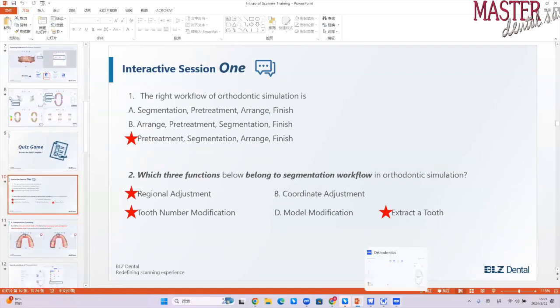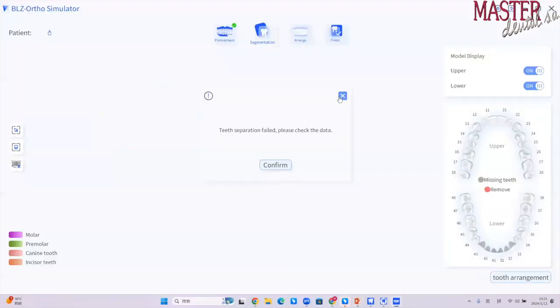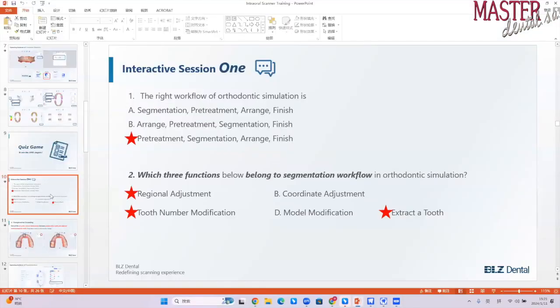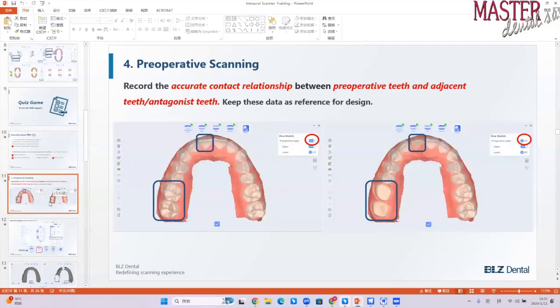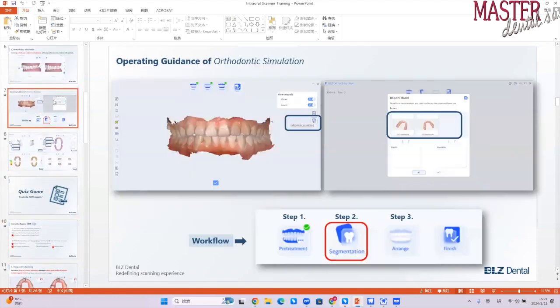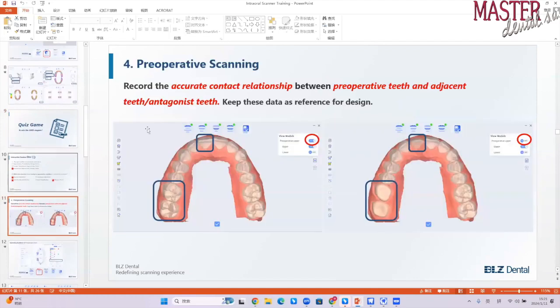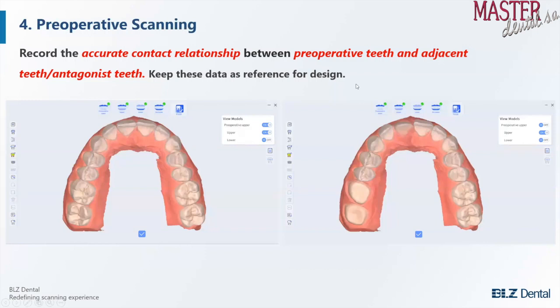I think there's some small problem with my computer because I opened too many programs. So I will show you this author simulator workflow later, okay? I will check the software later. So we can just skip this part since most of you already know this function operation very well. Then we can just go to the next function. This can save us some time.